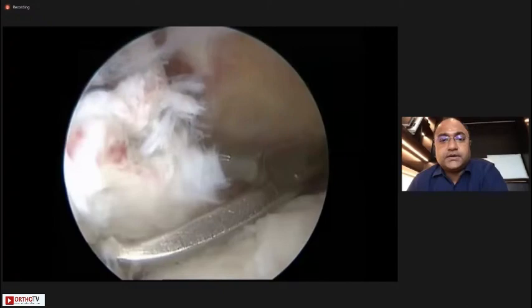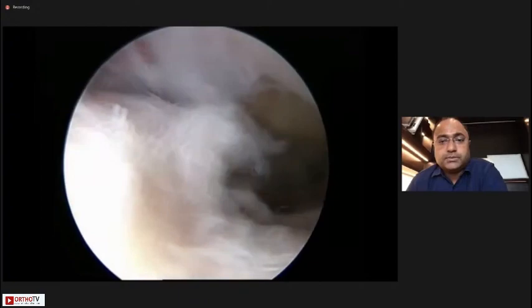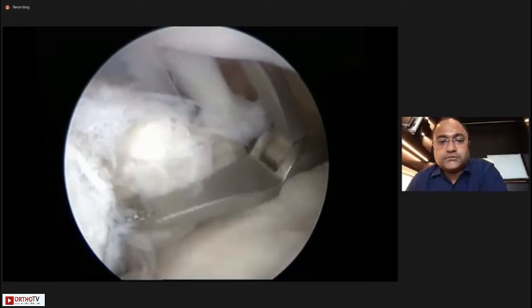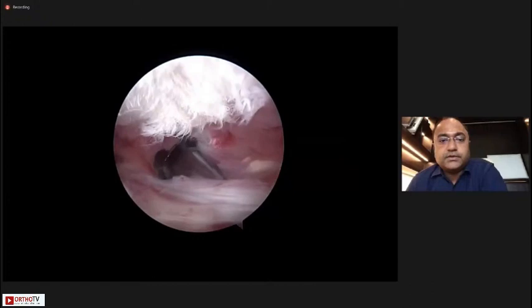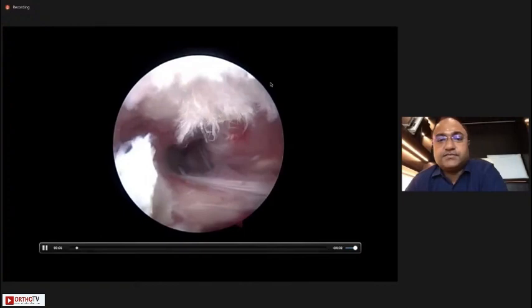This is her tear — a massive retracted tear. Viewing from the posterior portal on the right shoulder, I am unable to get the cuff all the way and it appears irreparable. The first thing we do is enter the subacromial space. The coracoacromial ligament is completely frayed. We start doing a little CA recession using the radiofrequency device.